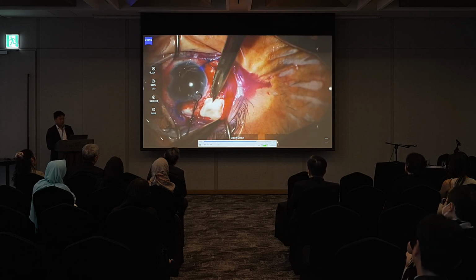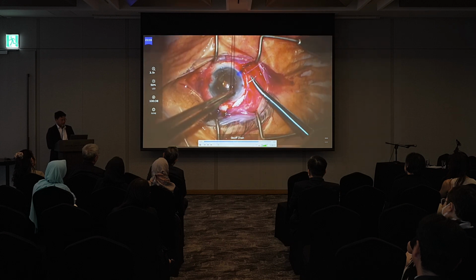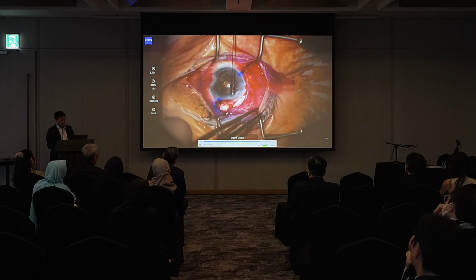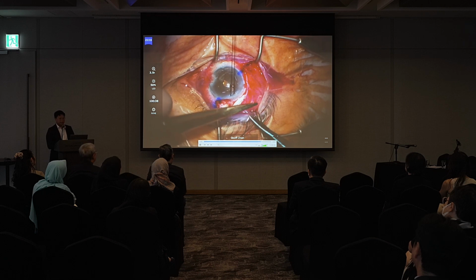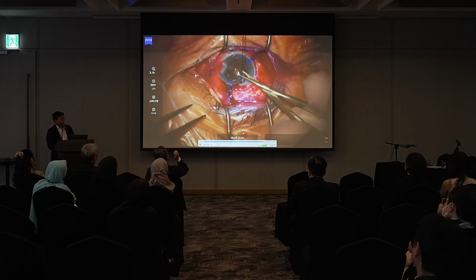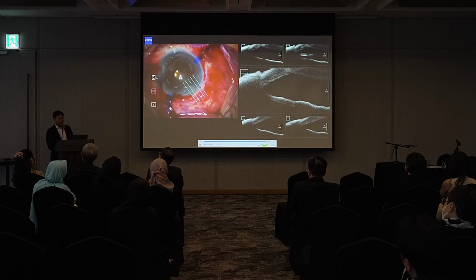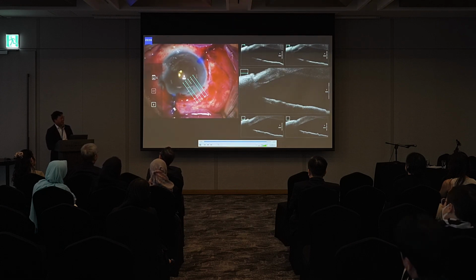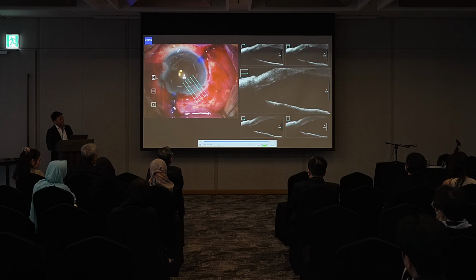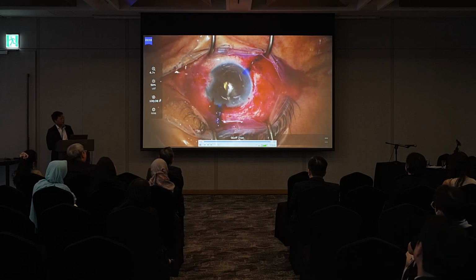So we're going to cover things up with our scleral patch, secure the scleral patch, and here you can see it's really quite tight, but it comes together well. But that's really quite fibrotic conj tissue, right? So for the training glaucoma surgeons, I always say we're conjunctival surgeons, right? At the end of the day, we're not really glaucoma surgeons. And that's me checking my tube and its insertion away from the endothelium.